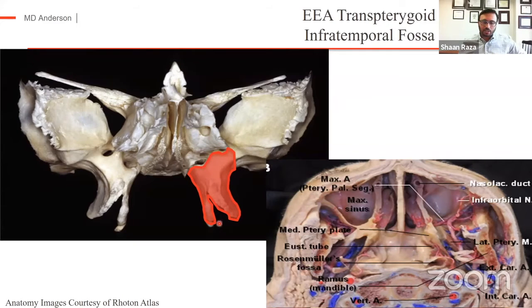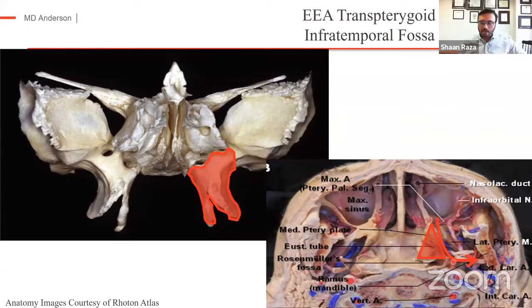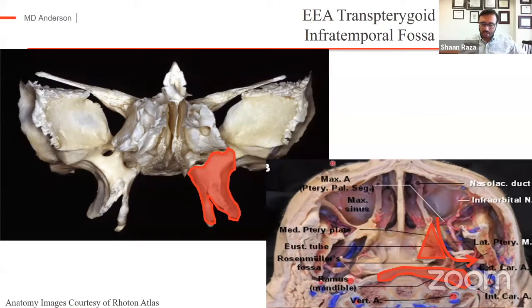V2 exiting foramen rotundum is identified to really isolate the medial and lateral pterygoid plates, which can then be resected in their entirety — going anterior to posterior while skeletonizing V2, going back to Meckel's cave, and following the vidian nerve all the way back to the carotid artery. For a petroclival lesion, this allows you to gently laterally mobilize the infratemporal fossa contents so that once you get back to the skull base, you can have access not only to the midline, but all the way out to the parapharyngeal space, the jugular foramen, and the lower cranial nerves.